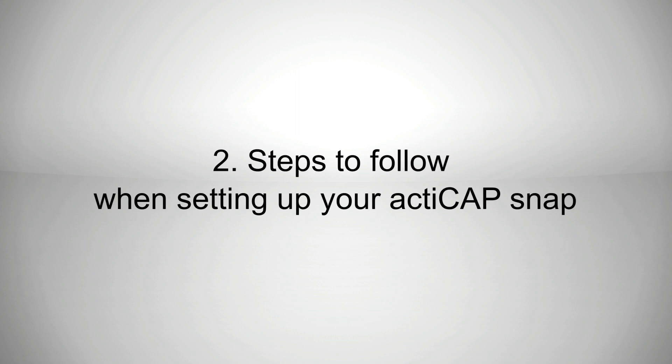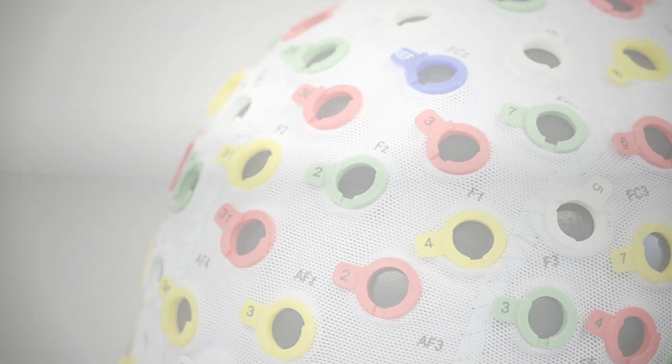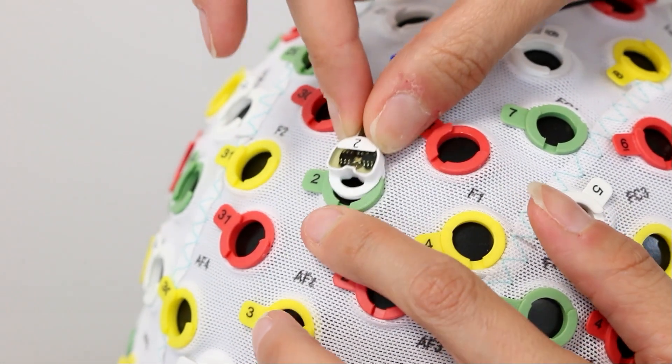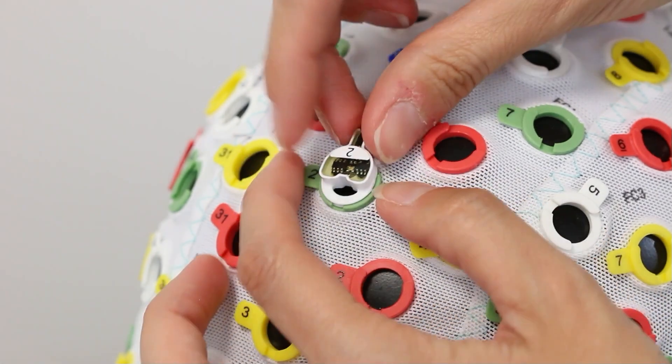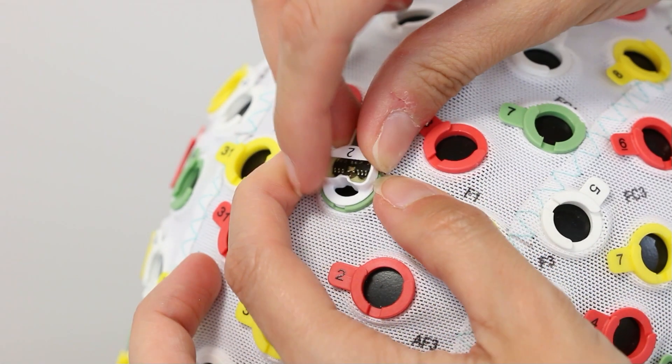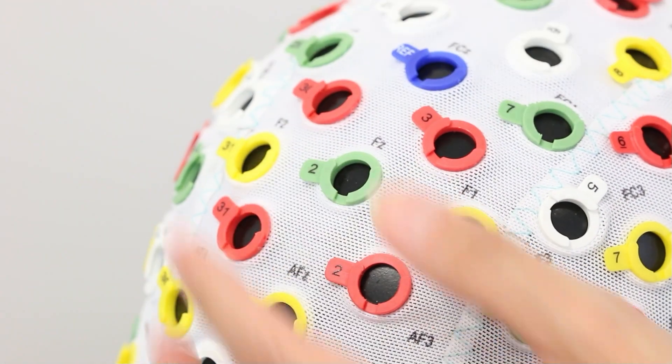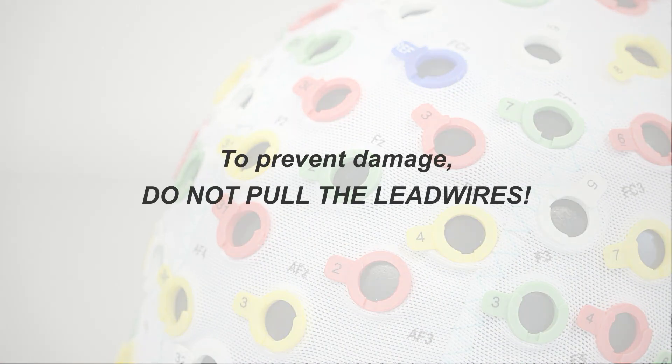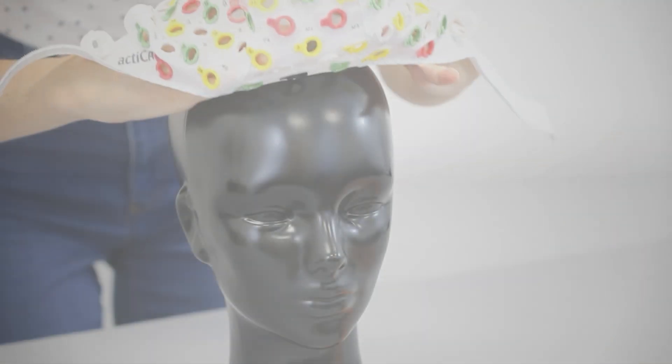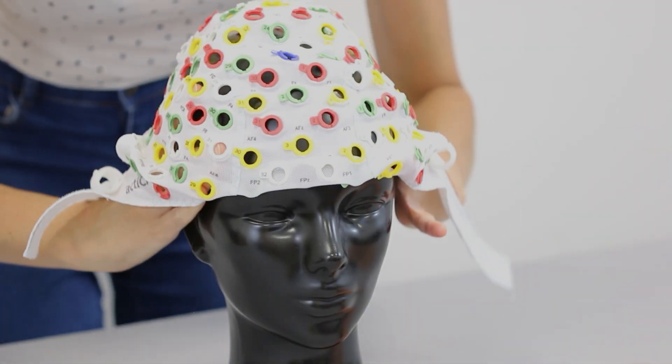Let's now walk through the steps we usually follow to set up an ActiCap snap cap in a nice and neat way. Remember to always hold the electrodes from the housing when inserting or removing them from the holders. Also, make sure you do not pull the lead wires to prevent damage. First of all, place the ActiCap snap cap on a model head.